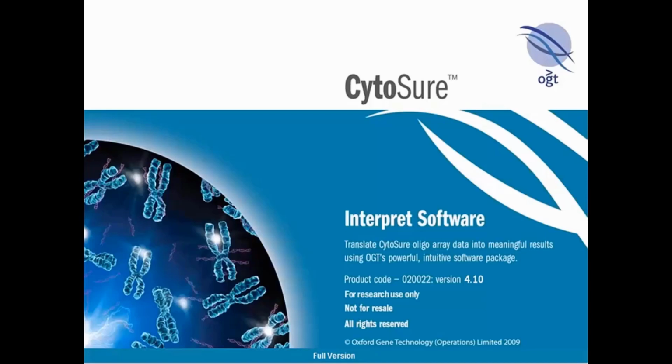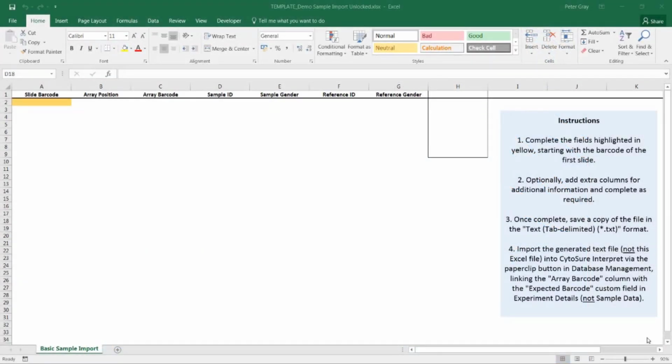The sample information you wish to import needs to be in a text file format. This could be generated from a LIMS system or created manually by the user in Excel and saved as a text file. Here is an example of a basic Excel template which can be provided by OGT. The text file will need to have array barcode and sample ID as a minimum. Users also have the option to include other columns as required.